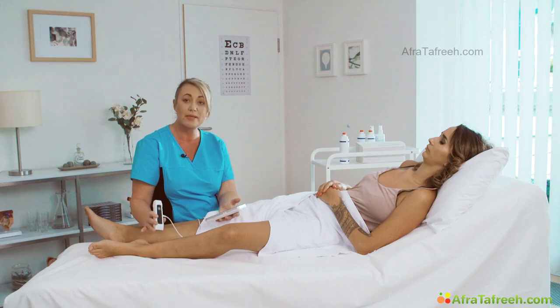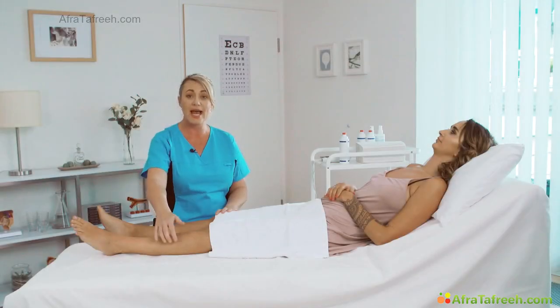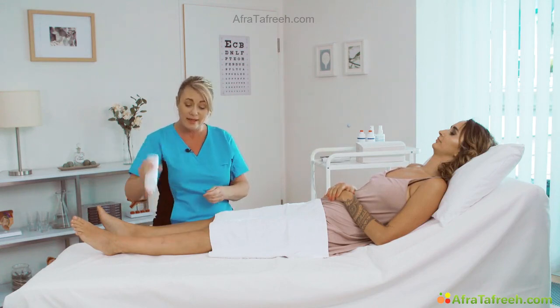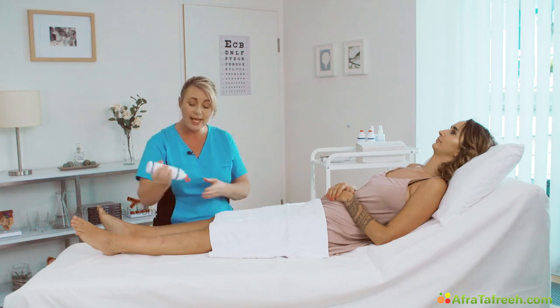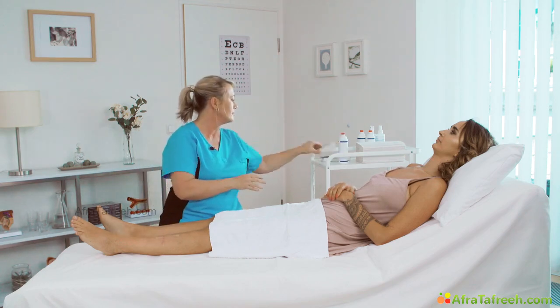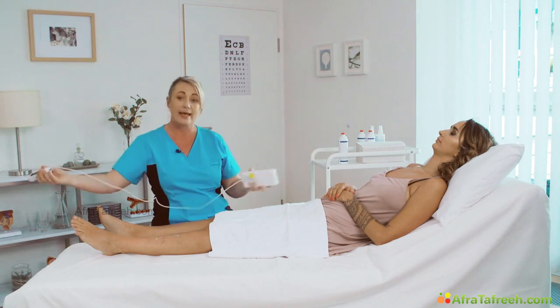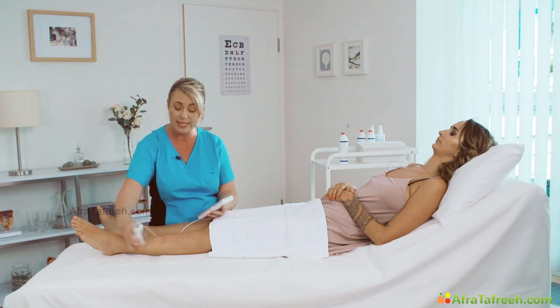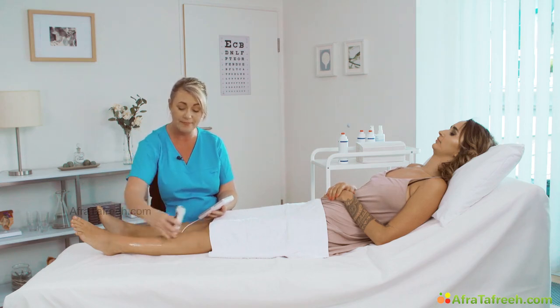This concludes our medial access to our calf veins, and now we're going to reposition the patient to look at the anterior tibial veins. We've repositioned the leg now so we can access the anterolateral part of the leg. This way we can view the anterior tibial veins. Another little bit of gel down the leg. Again, placing the transducer into a transverse plane and spreading the gel down that area of the leg.